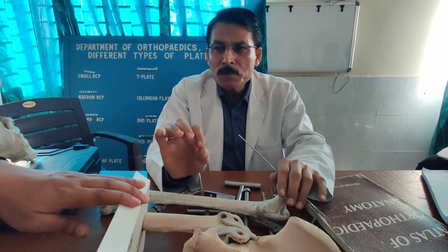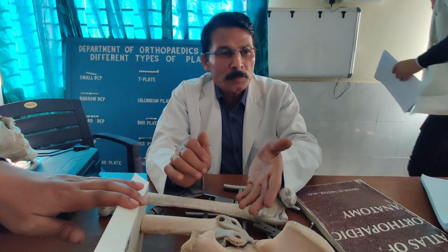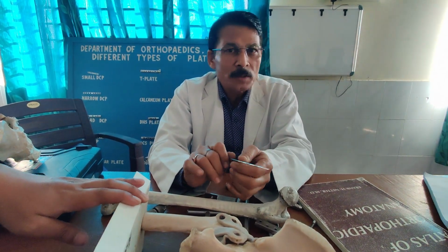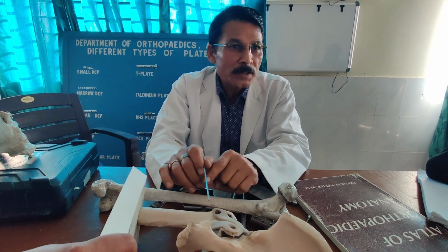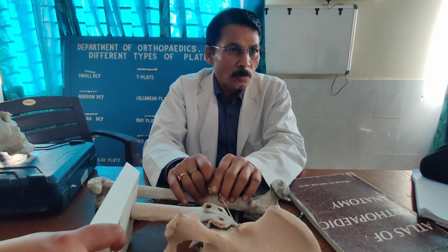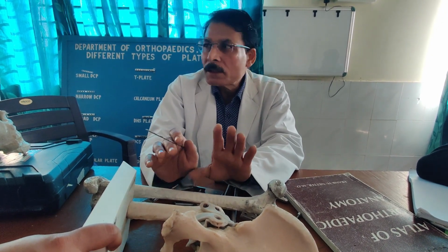But it is always mandatory to maintain the reduction during the fixation. For this purpose, somebody can support it, or you can apply various K-wires around, anterior and posterior. That can be done for PFN cases, how we used to do. The same principle can be applied here also to maintain the temporary reduction during the process of fixation. So that is a technique.